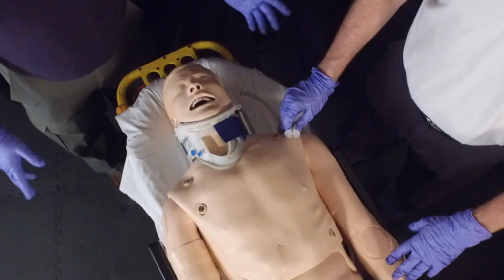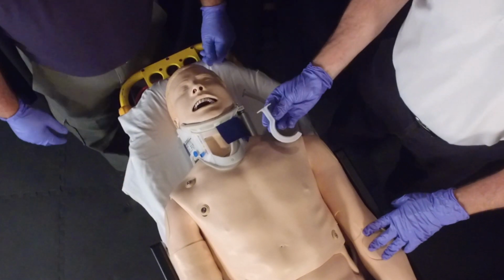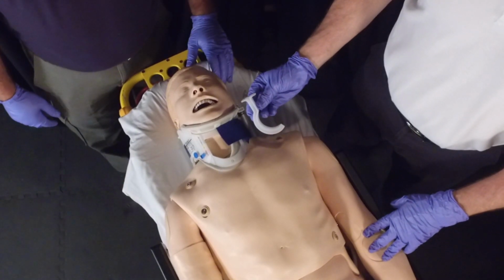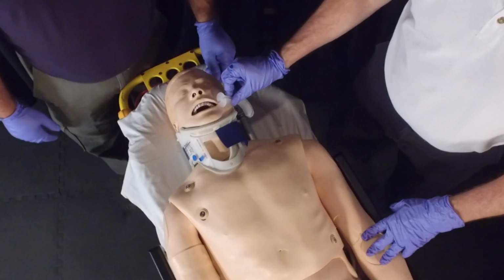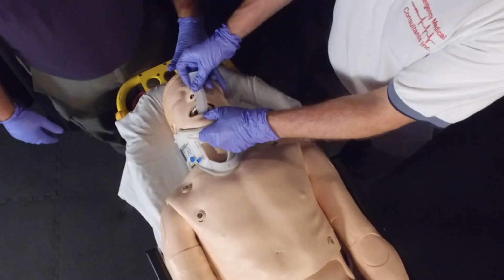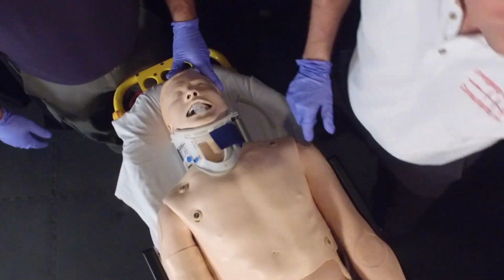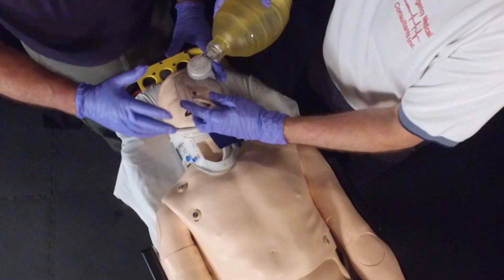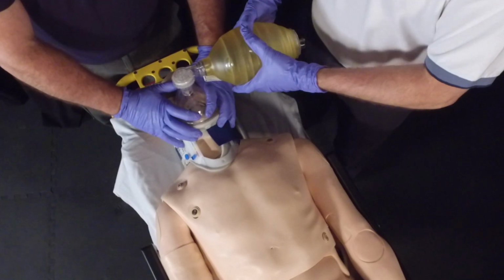So the first device for maintaining the patent airway is the oropharyngeal airway for the patient who does not have a gag reflex. Remember, measuring that has not changed, from the angle of the jaw to the corner of the mouth. So we place that into the patient as appropriate, and then if possible, ventilating that patient with two persons gives a better mask seal, makes it easier for the person who's ventilating to get adequate tidal volume.